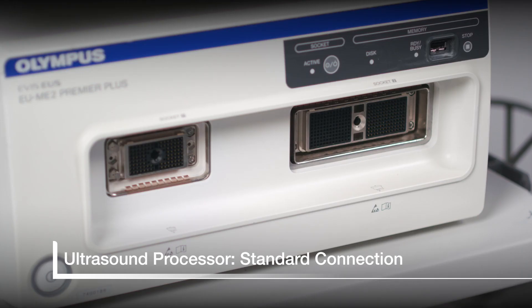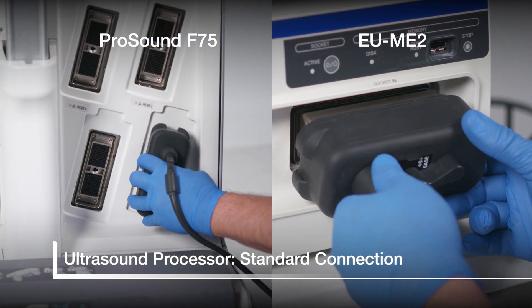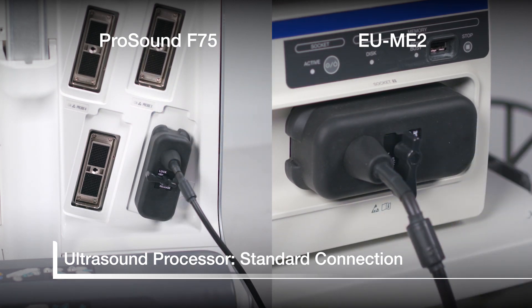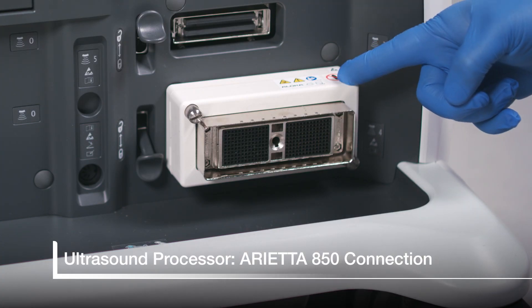This is a standard connection that you will find on many ultrasound processors. For these connections, the cable should be either toward the top or to the left. As processors evolve, so do the connection ports.